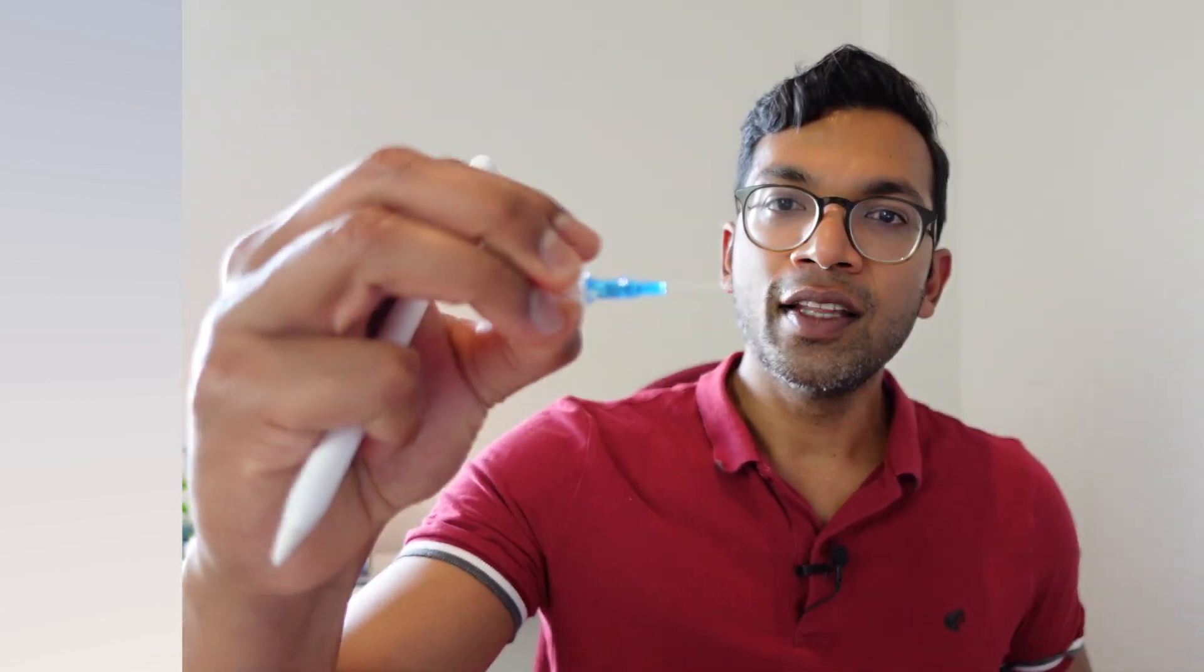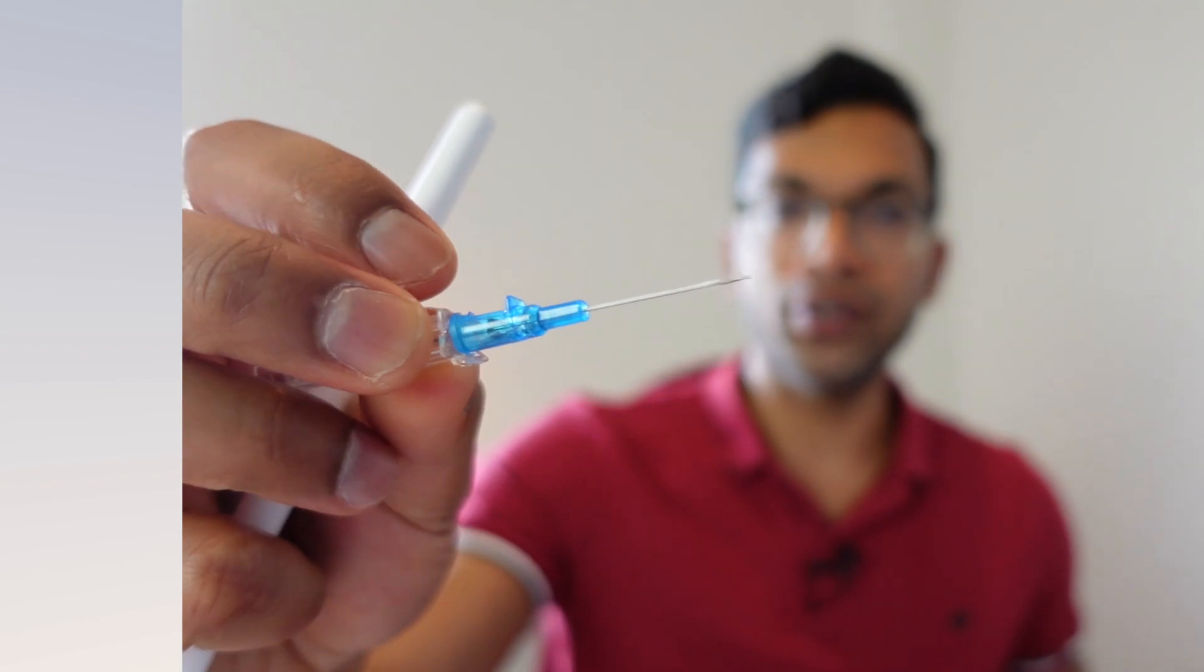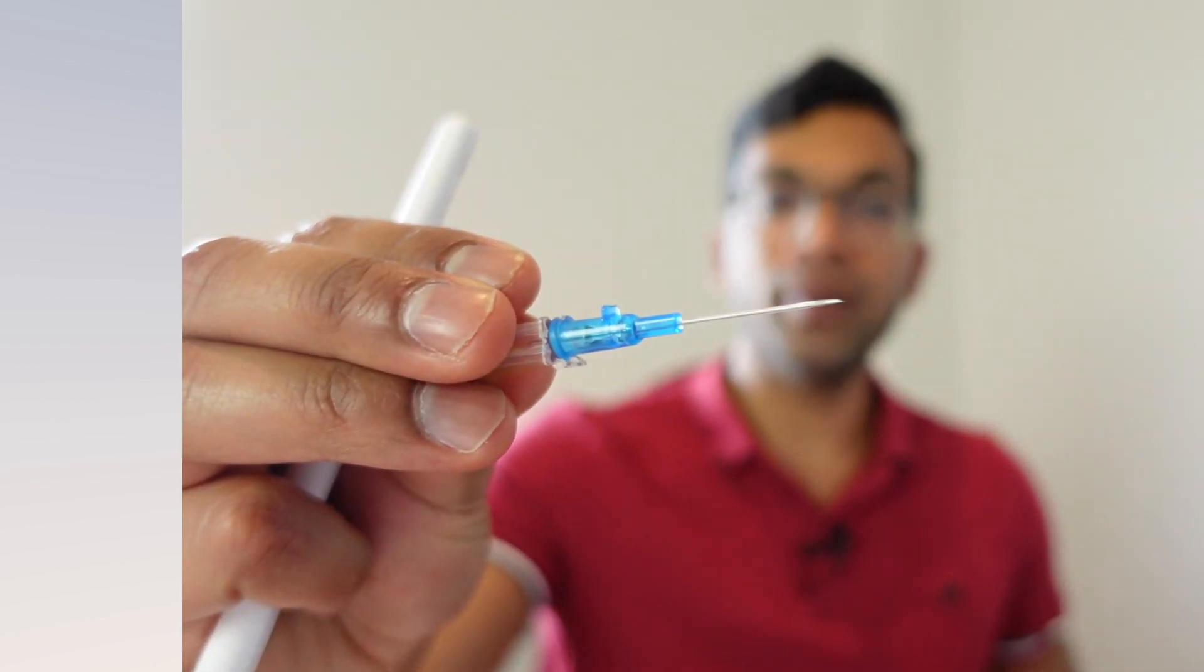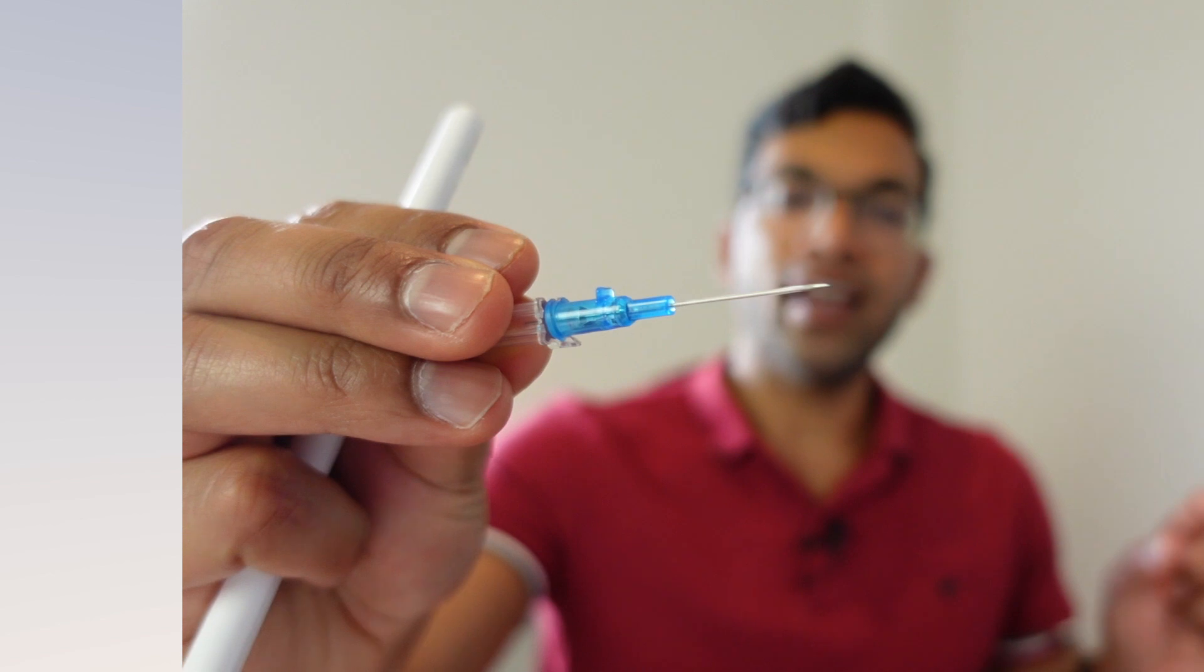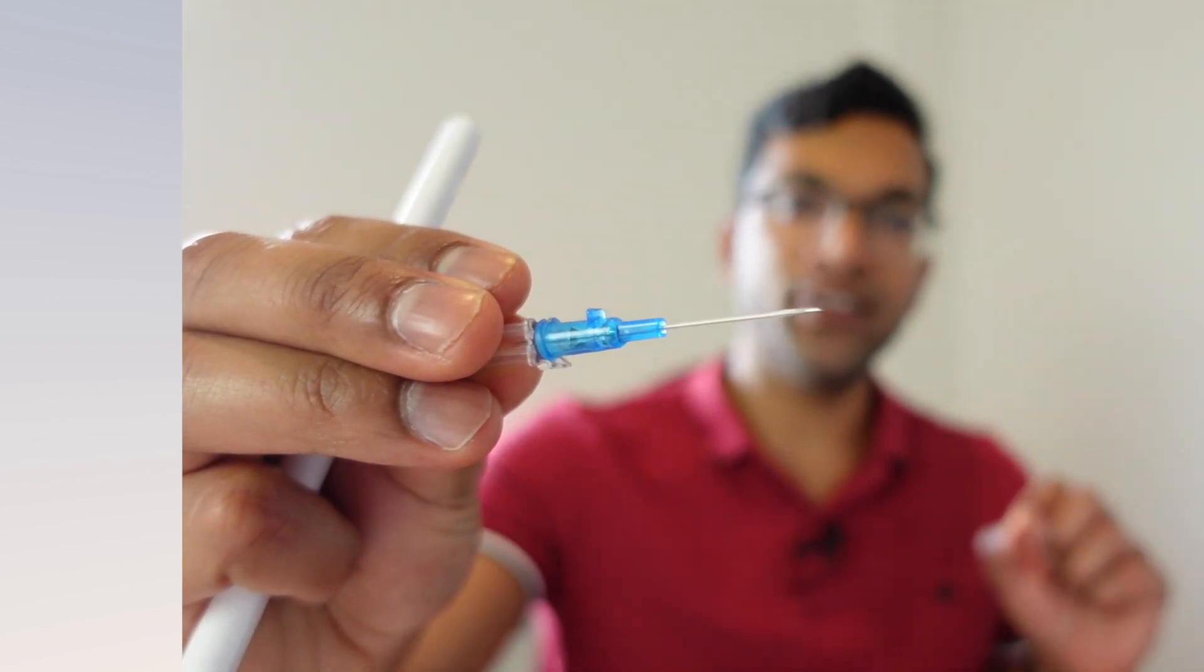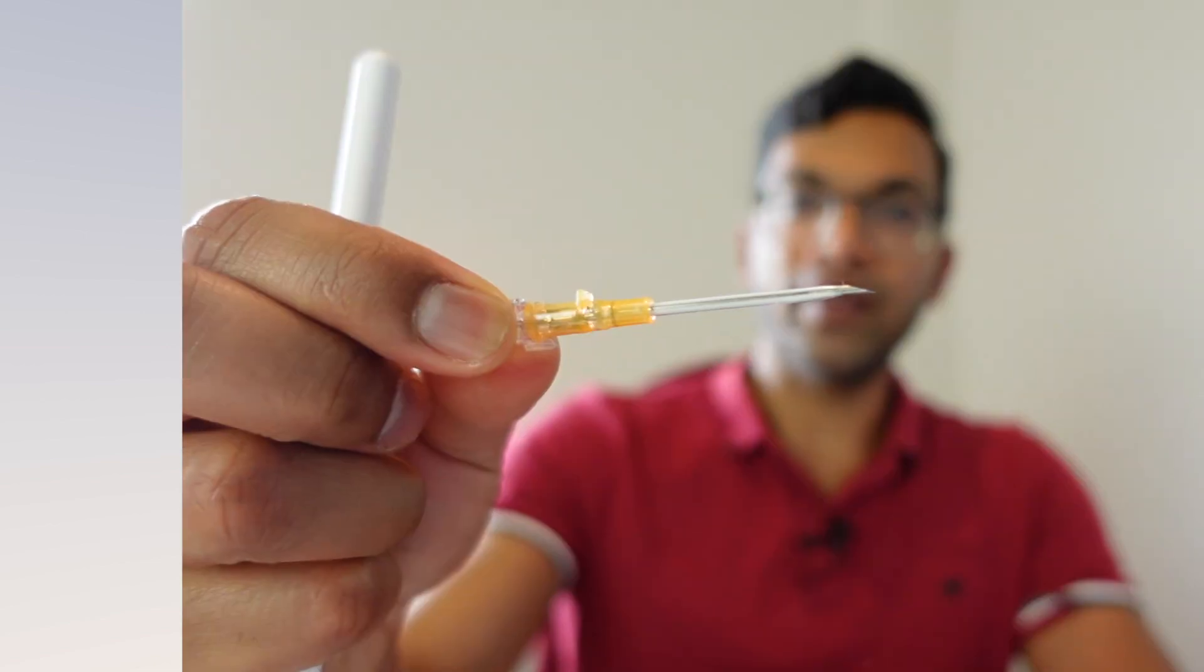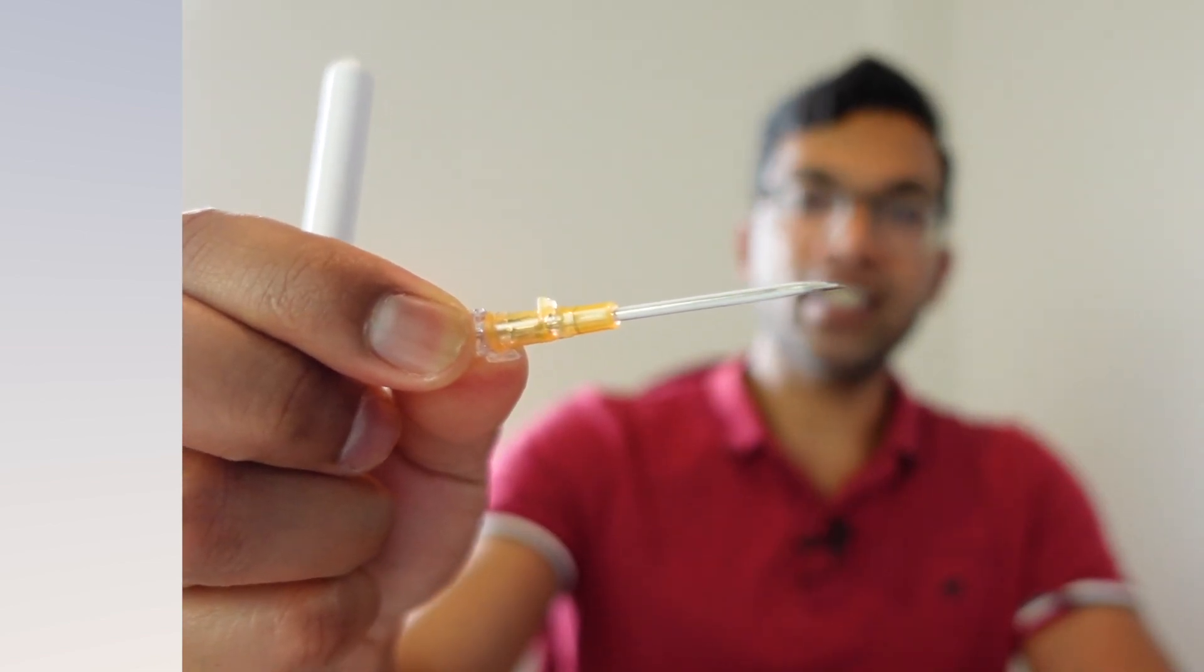A 22 gauge cannula like this one, the bevel is only about a millimeter or two. That means that you only have to advance it about three millimeters, maybe four, before you enter both the needle and the cannula into the vein, and therefore you can advance the cannula fully within the vein.